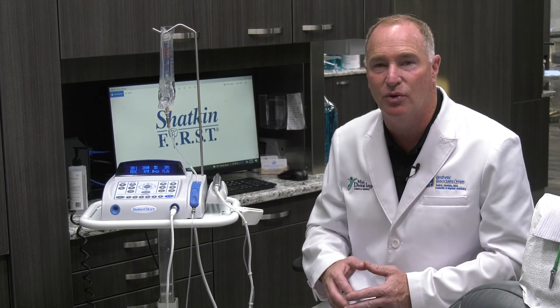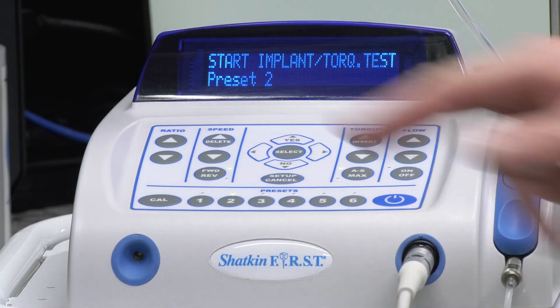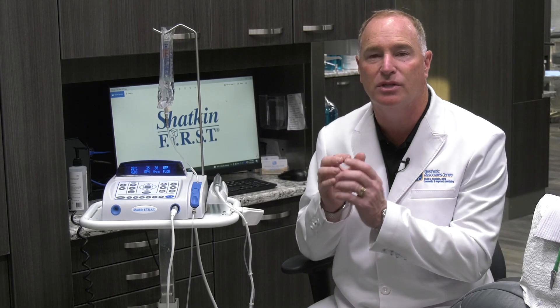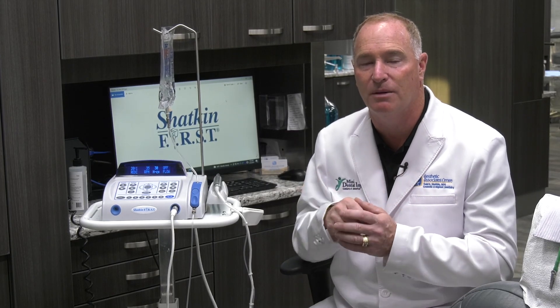Now once you place your pilot hole, the next step is what we call the torque test. The torque test measures the newton centimeter torque that the implant is going into the bone. If you came to one of our Shatkin First seminars, you may recall that the minimum torque we need to restore a mini implant the same day is 30 newton centimeters of torque.